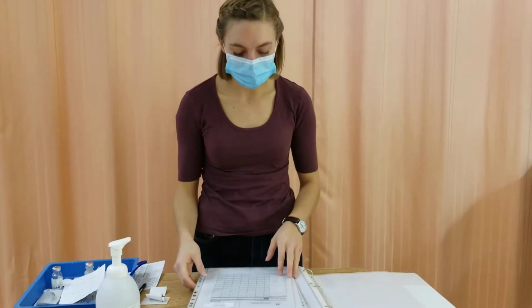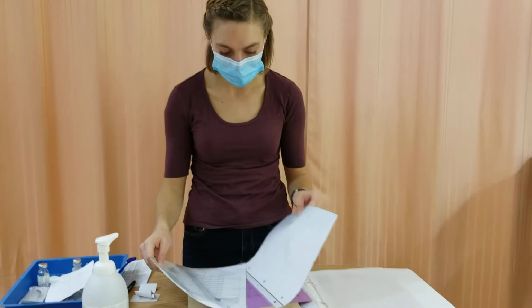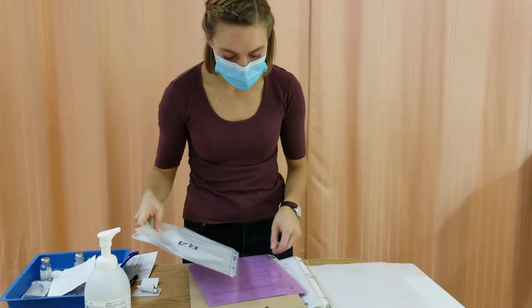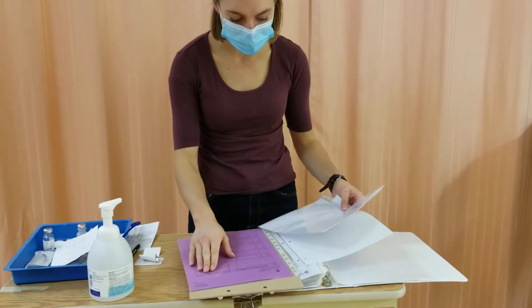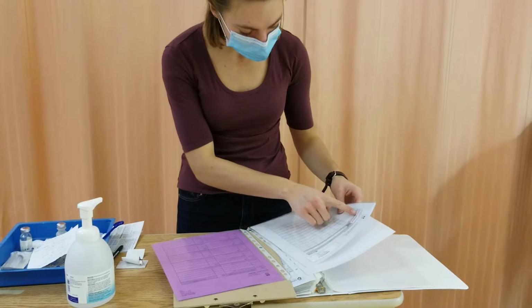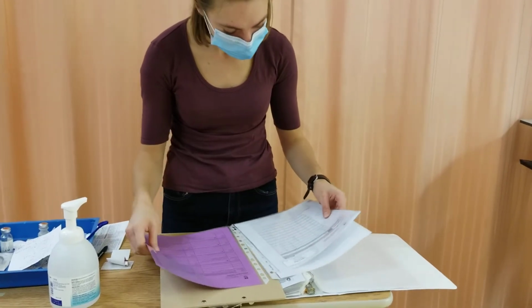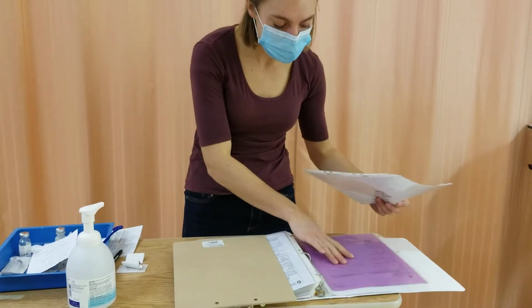I'm Madeline. First, I'm going to be giving a demonstration on how to give an IV piggyback medication. So first I'm looking at the completeness with the physician's orders in the MAR for Dore Dabney. And they're complete. And notice she's allergic to morphine. And everything's the same. So I've done that.